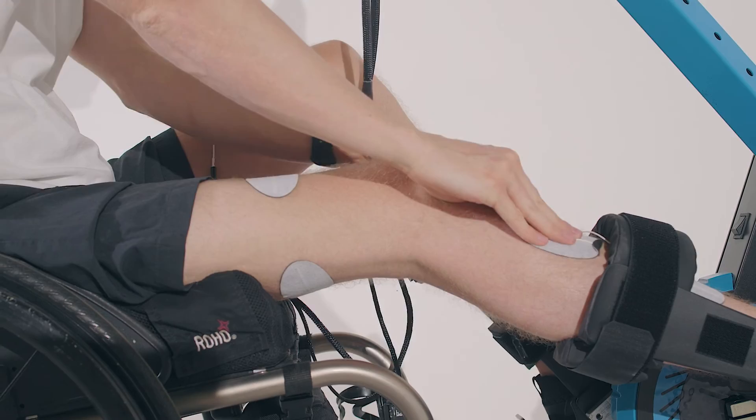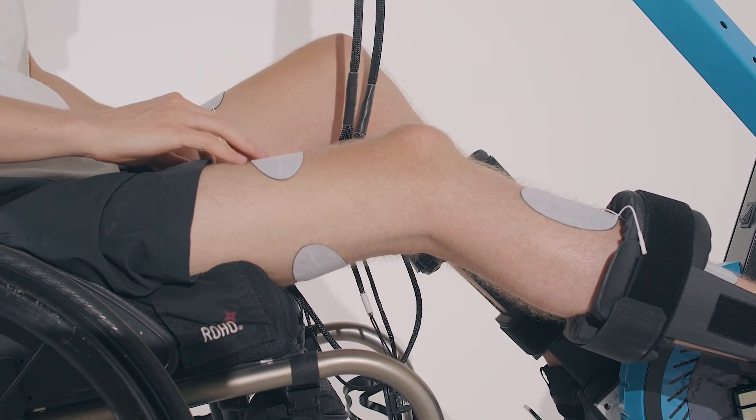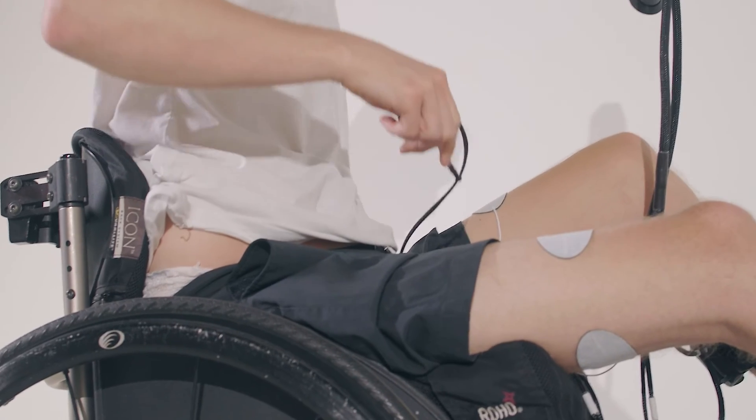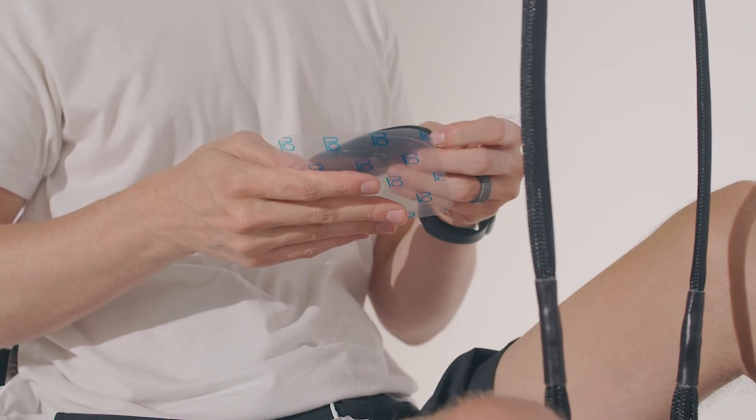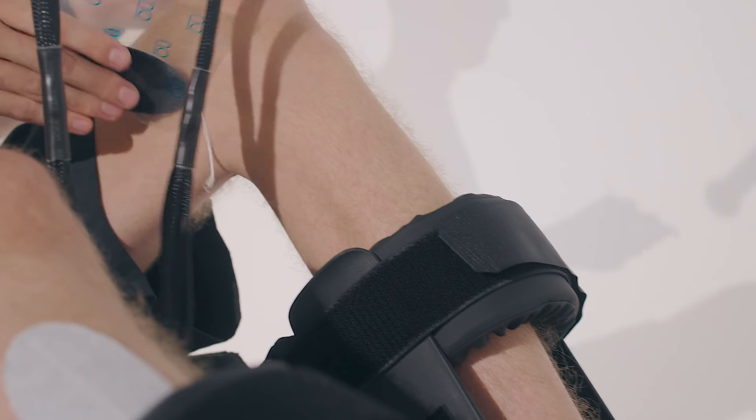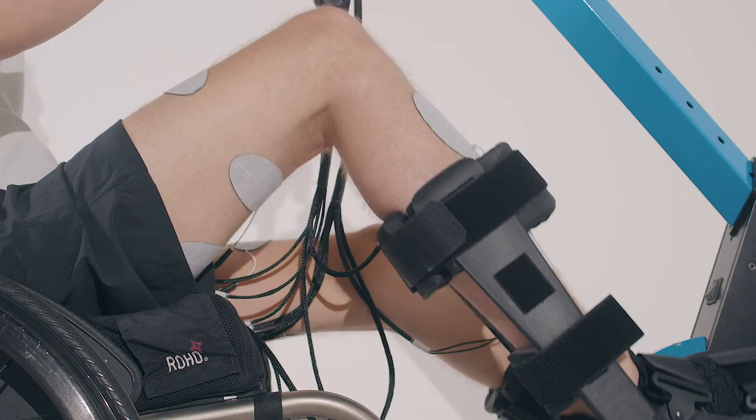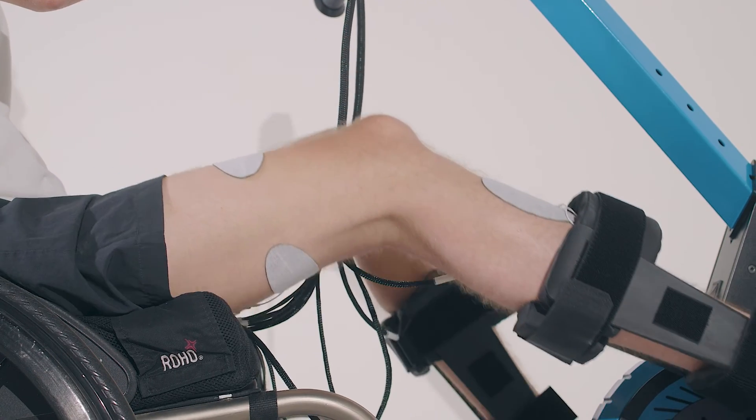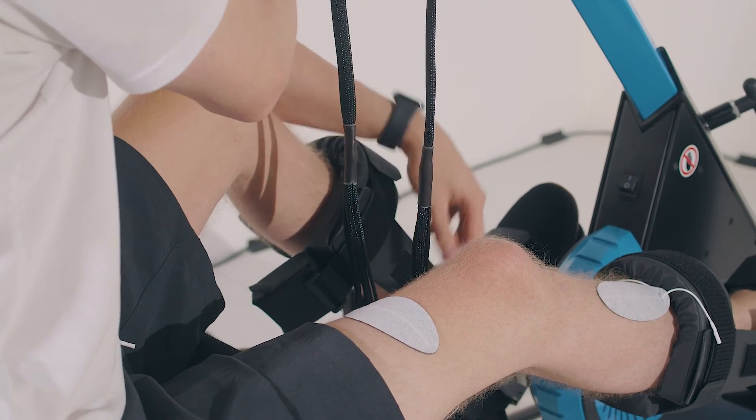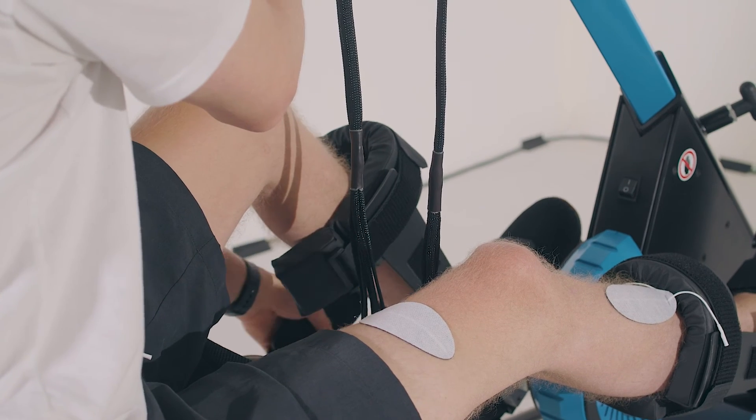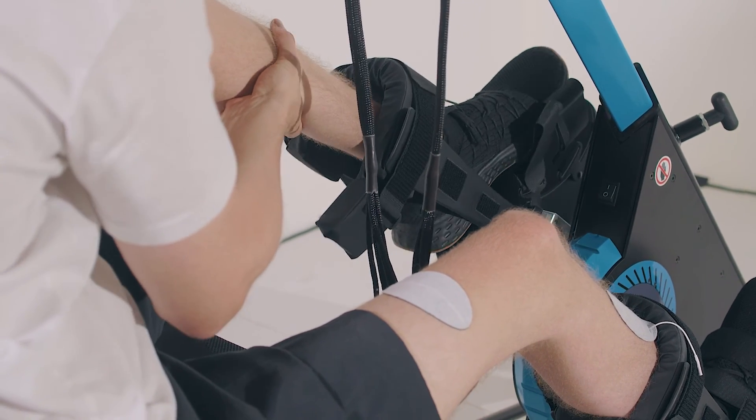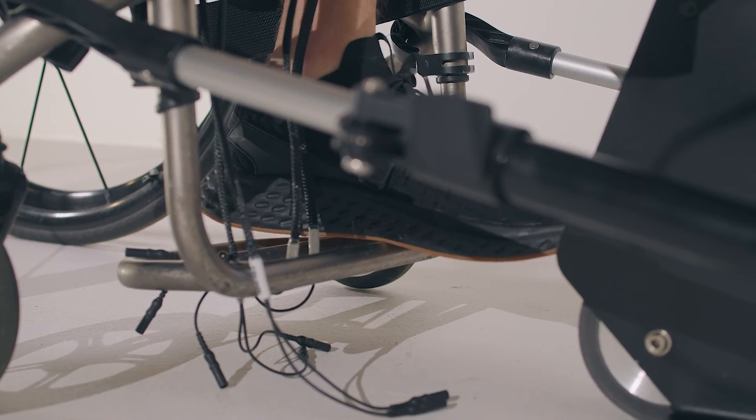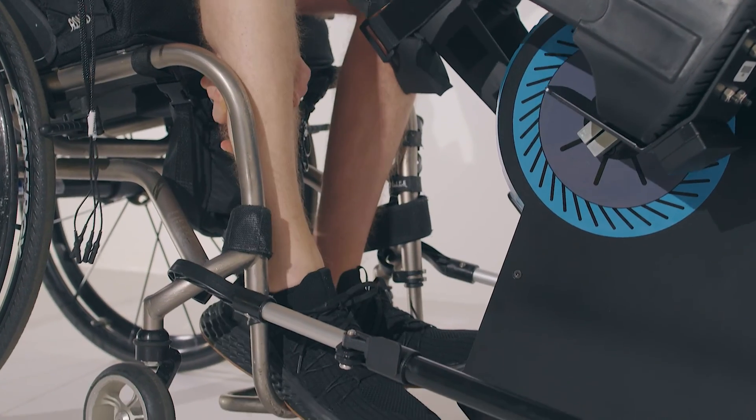To dismount from the myocycle, first, completely disconnect the stimulation cables from all the electrodes. Remove the electrodes on your quadriceps, hamstrings, and lower legs and return them to their plastic liners. Next, use the rotate pedals feature to bring one pedal close to you and open all the straps. Use the rotate pedals feature again to lower this pedal to the ground, where you can easily lift your leg out of the pedal. Repeat this process with the other leg.